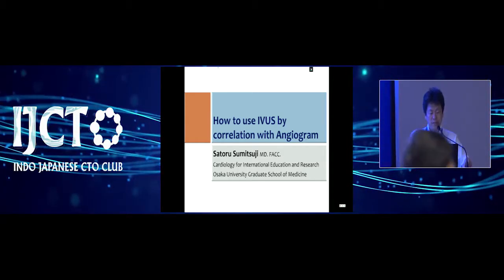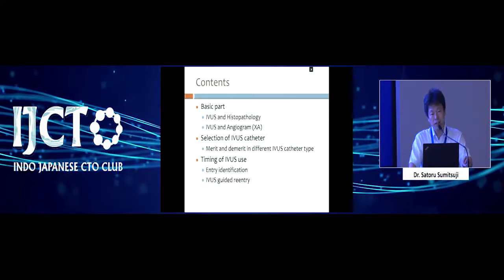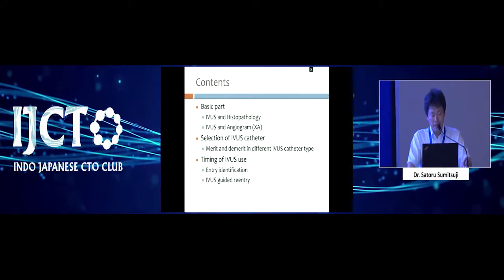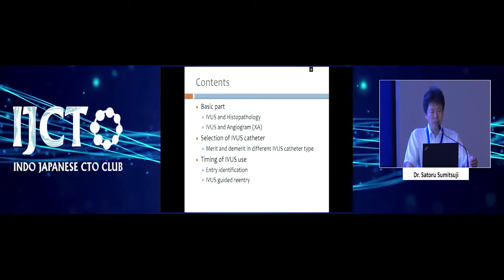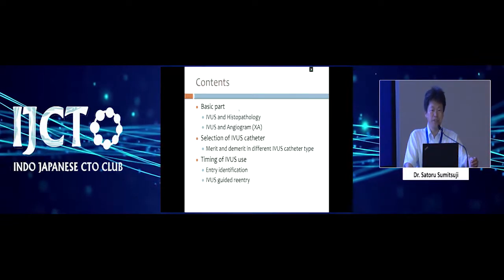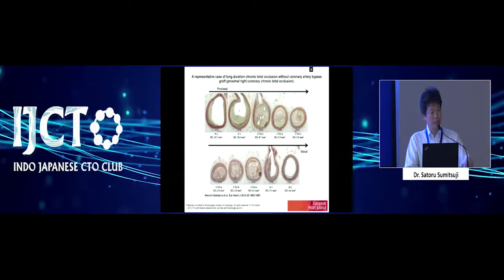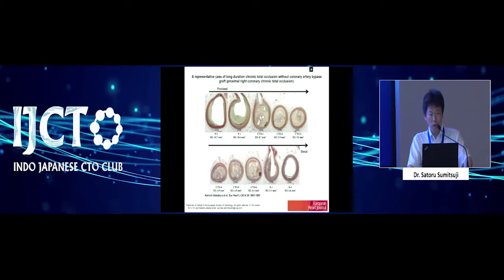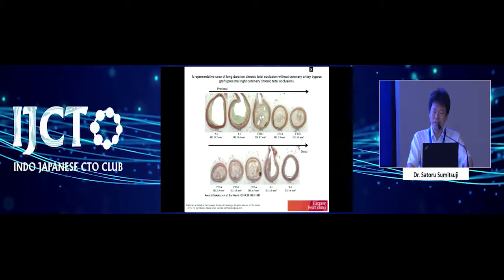Thank you. I'm going to talk about the IVUS and the re-entry in the antegrade approach. But before talking about IVUS, we must know about the more basic part. What is the basic part? That is histopathology. As you know, many doctors talk about subintima. But where is the subintima? Why is the subintima important?